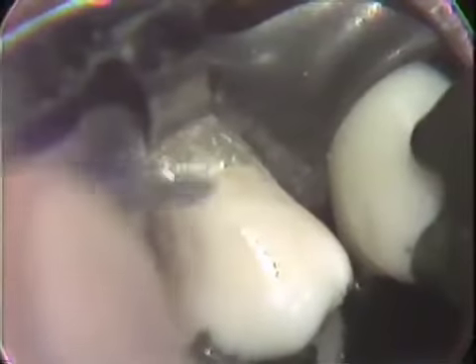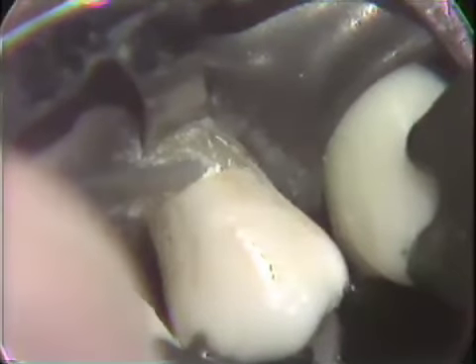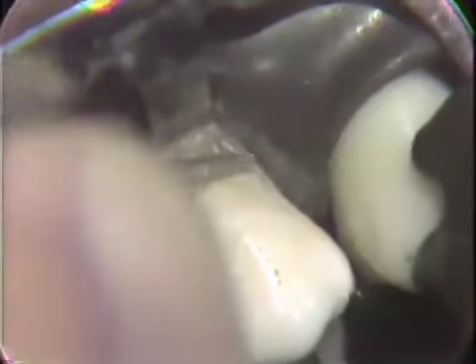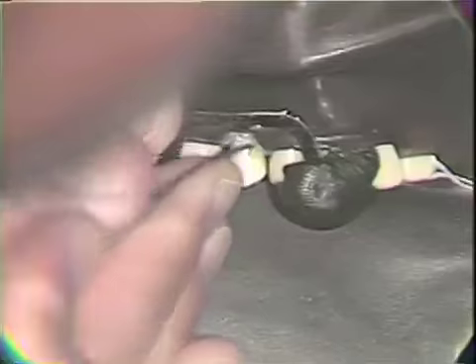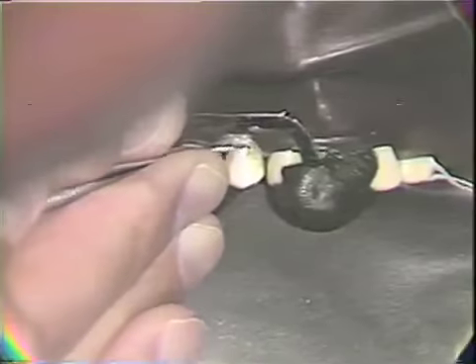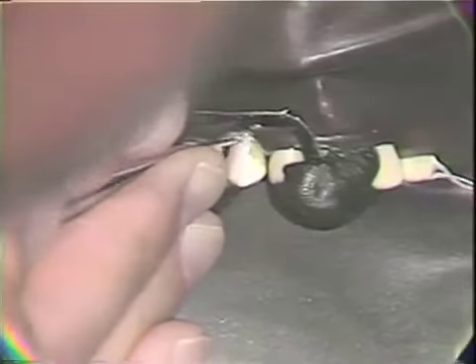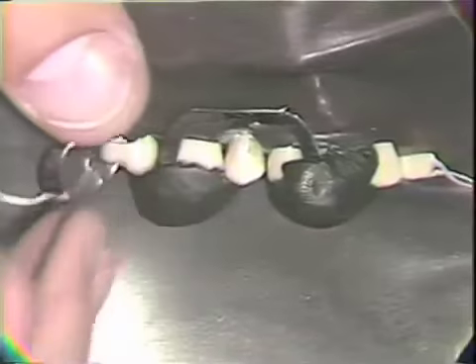I'm swinging up just a bit into a 9 o'clock position in order to better approach that occlusal wall to the mesial. Again, the only walls that we will have exposed in a usual situation with caries at and just cervical to the free gingival margin, the only wall that will be exposed will be that occlusal.